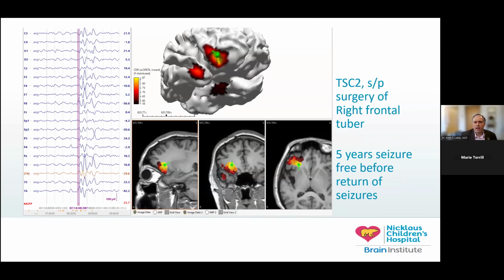The seizures are a little different now, but the patient typically has these bursts of activity, with both sides being active, but not quite synchronously. And they become very complex, and this occurs both interictally as well as at the beginning of the seizure. So this is a single spike analysis for the very beginning of this spike. And if we look, this spike is showing up in this anterior frontal region right here.